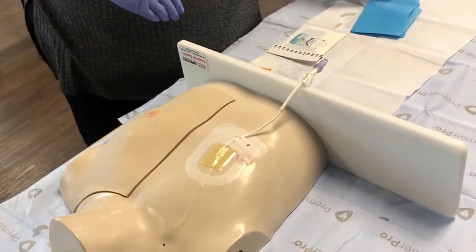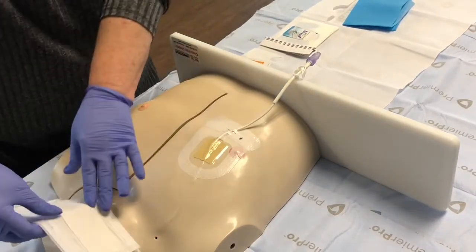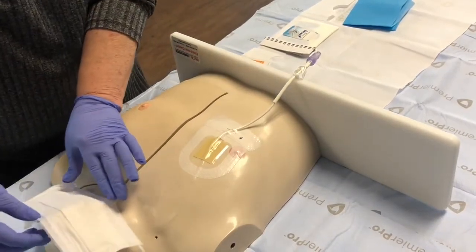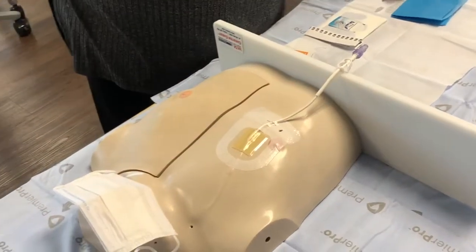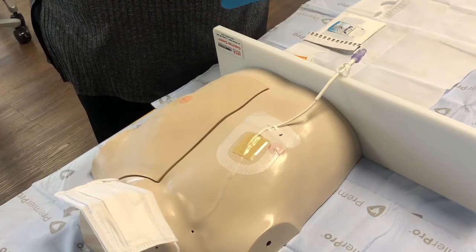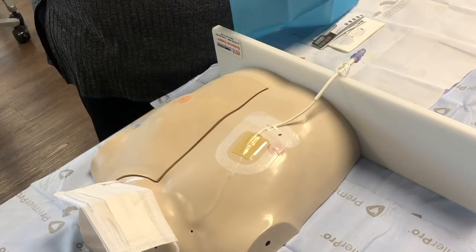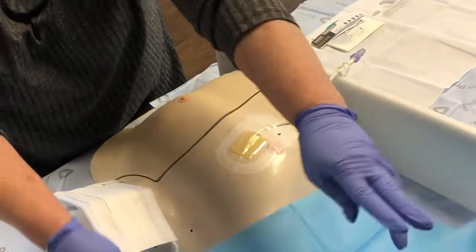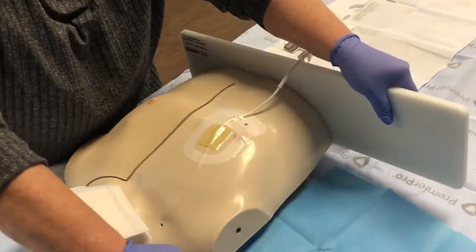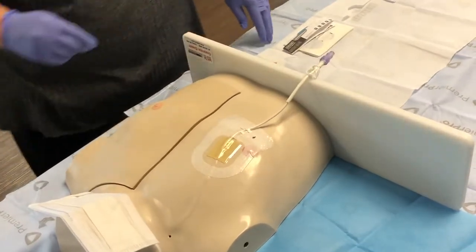Place a mask on yourself and one on your patient. If they can't wear a mask, ask the patient to keep their head turned to the side during the procedure. Have family members don masks if they are staying. Place the blue underlayment drape under the shoulder or arm where the catheter resides. This will decrease contamination of the exposed site.